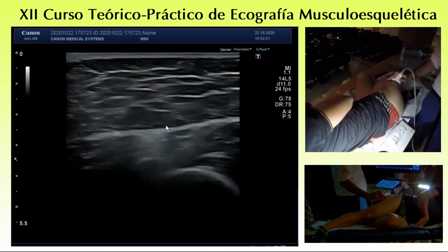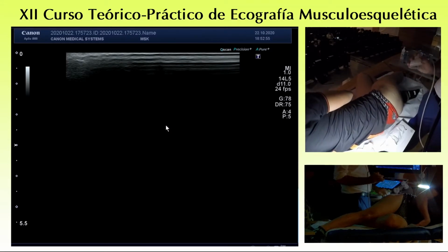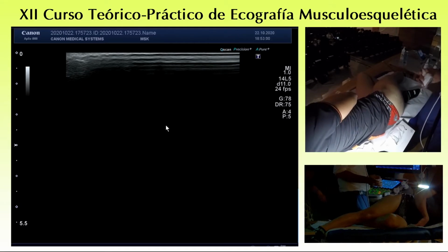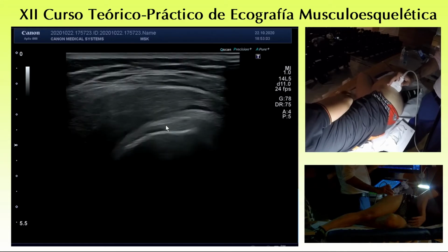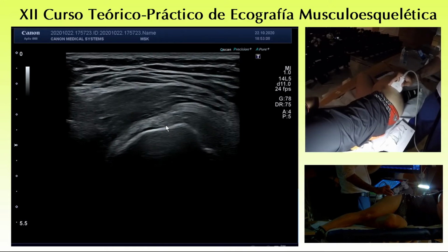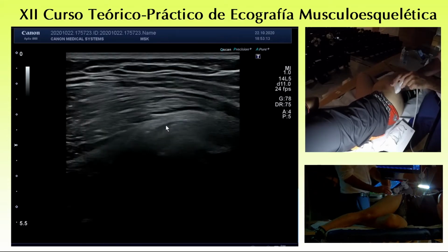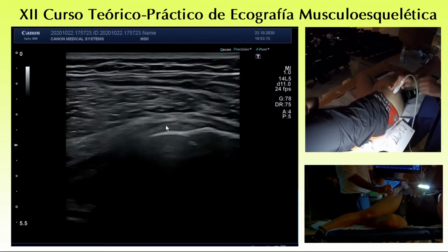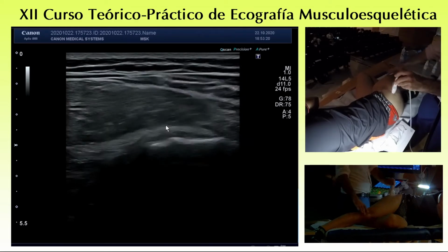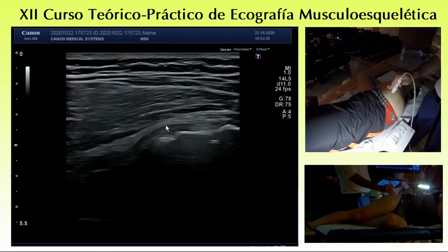Is there any specific question for the lateral hip? Well, of course, when you see a swollen hypoechoic muscle, you try to look if there is some interruption. I cannot perform a dynamic maneuver for that, but if you place the leg in extension in this position, the tendons are already very tense.